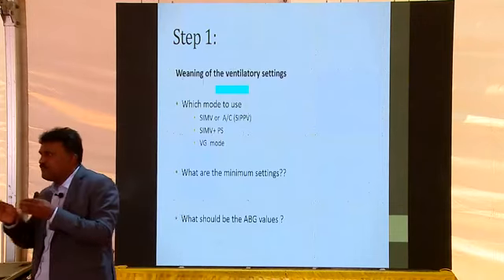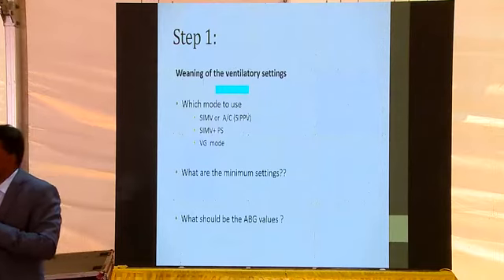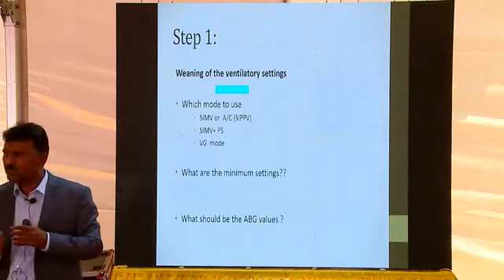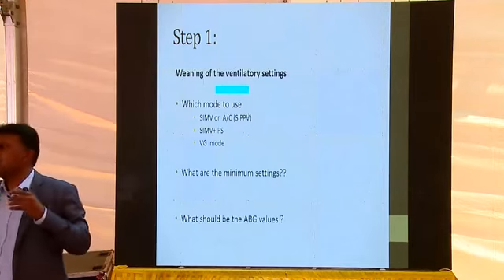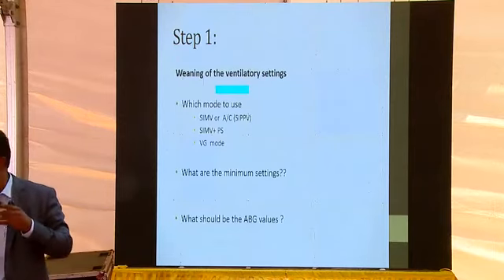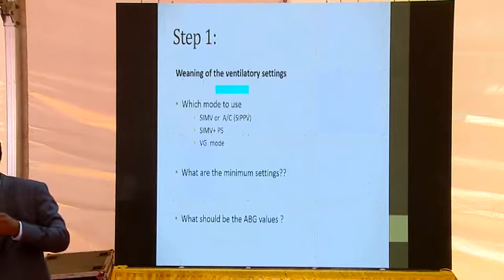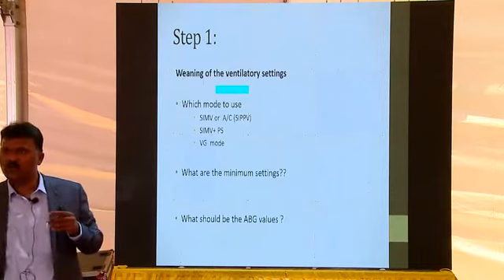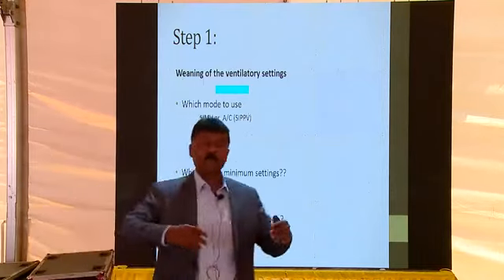That's why in SIMV we don't come down below 20-25 breaths, isn't it? We don't come down to 25, then 20, 15, 5, 0, and then wean him off. Do we do that? No, once we are on 20-25, we wean, because if you keep coming down further and further, you're increasing your time on the ET tube getting only PEEP, which is nothing but like an ET CPAP. Correct? Once you are on 20, 25, and this is assist control you want to do, it's still okay.